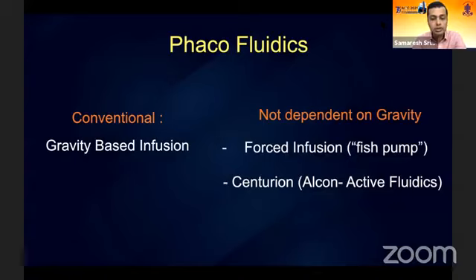And now a newer system of surgery called the Centurion Vision system, which I've been enjoying for the past 5 or 6 years and has been there for quite a while, which uses a newer concept of what is known as active fluidics. And I think it's patented by Alcon.